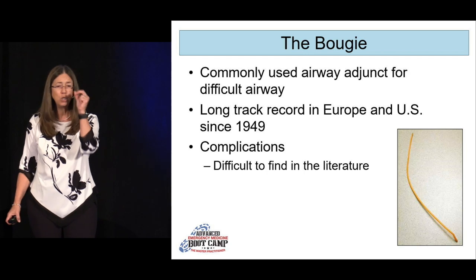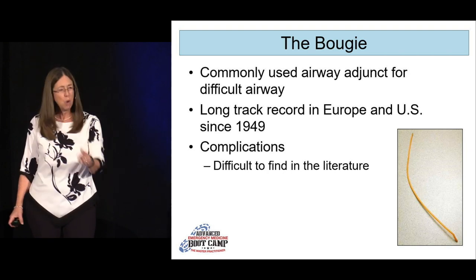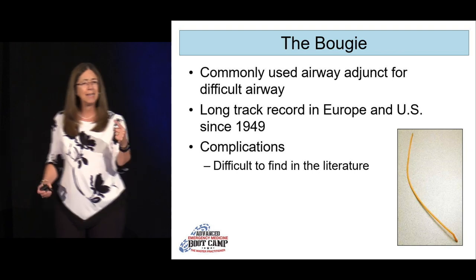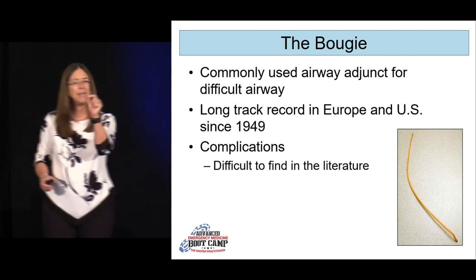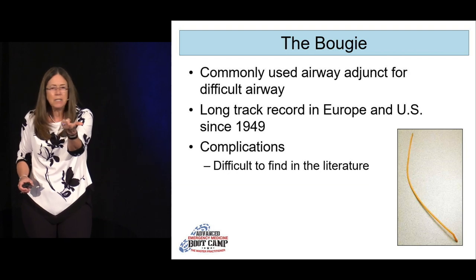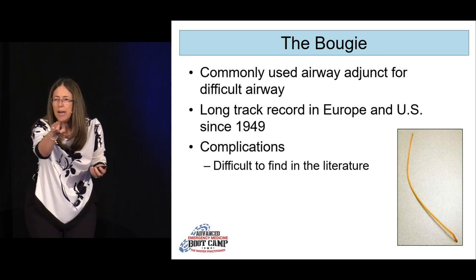If you see epiglottis, you know that the airway is just beyond, so just distal and anterior to that. You know that on purpose. That's anatomy. That just is what it is. So if all I can see is epiglottis, or just a little bit of arytenoids, I can take something that's a little bit stiff with a little bit of an angle at the tip, and I can feed that, or watch it go beyond the epiglottis and then slip up into that airway.